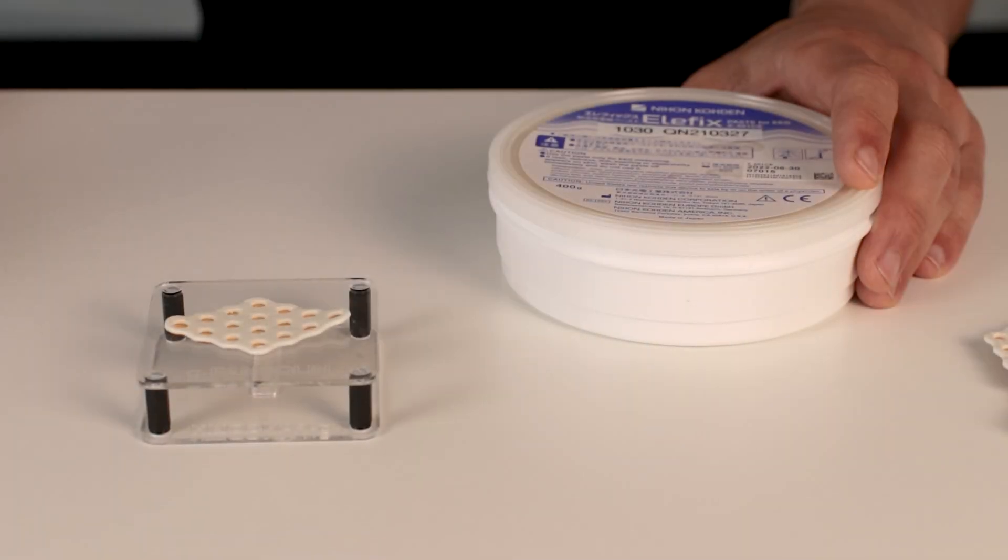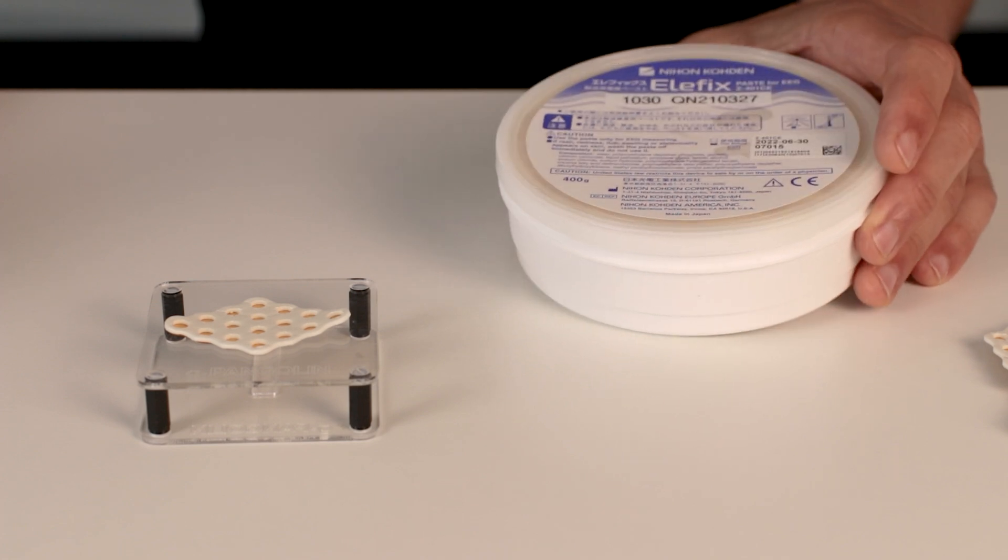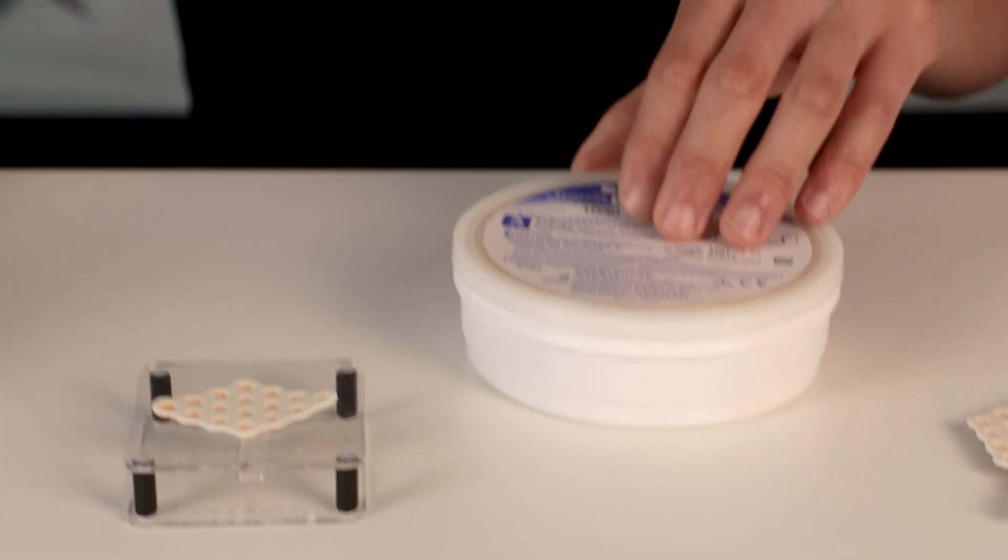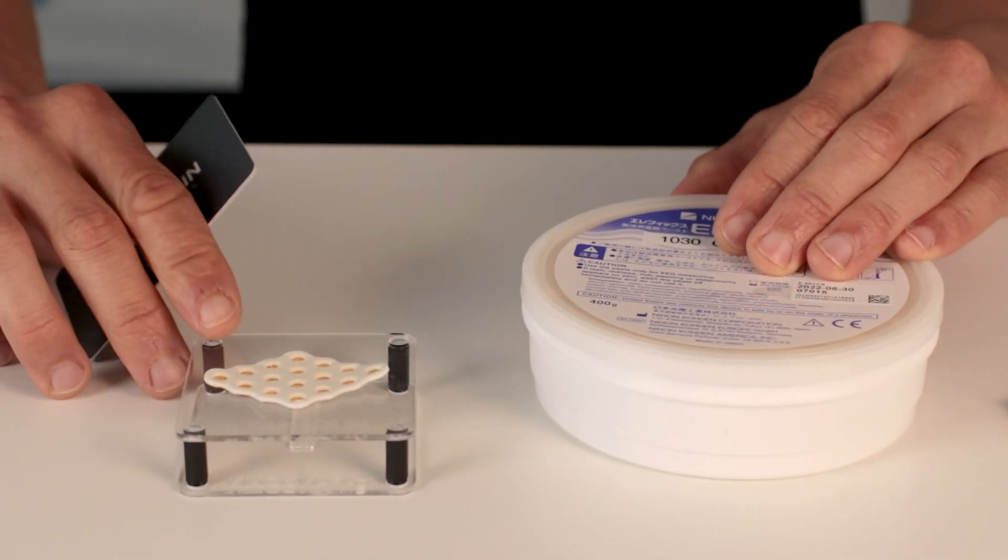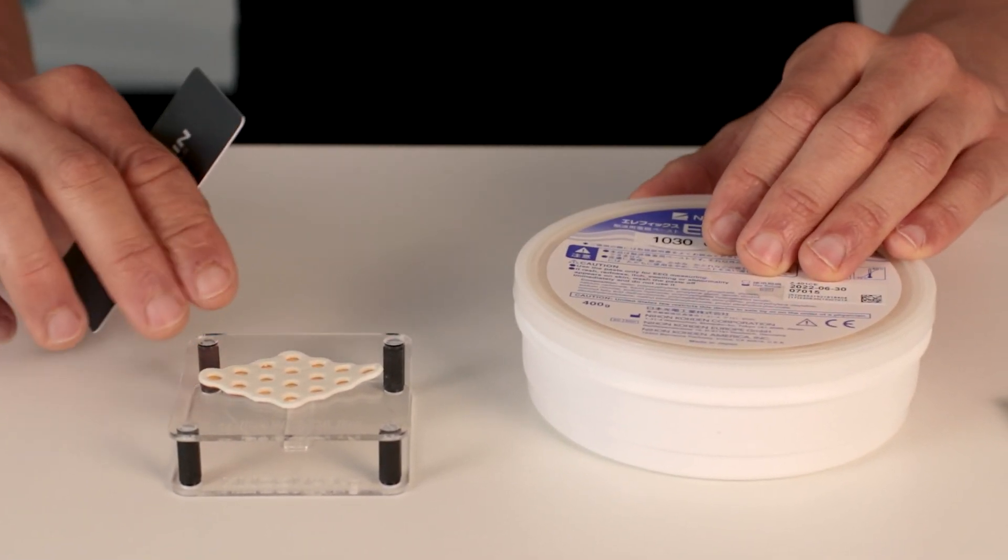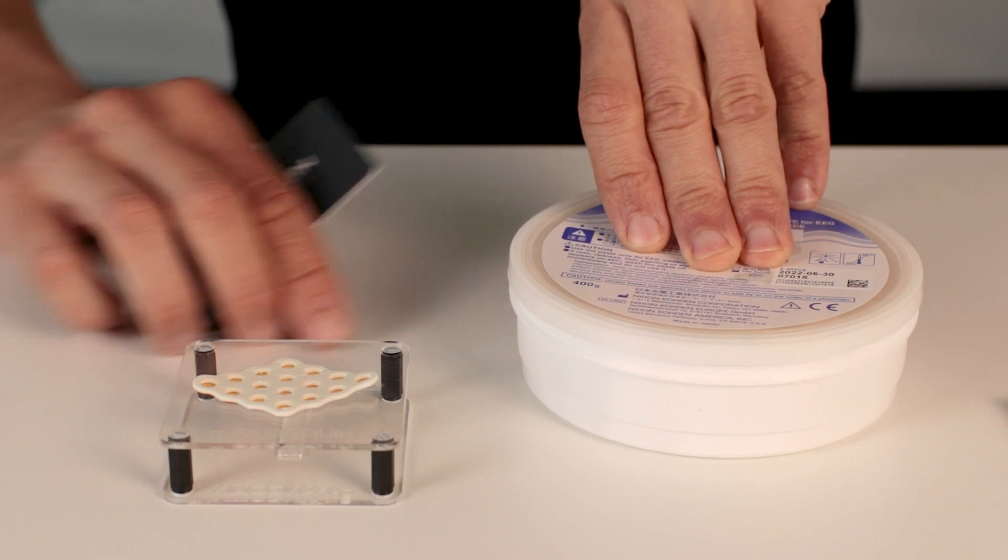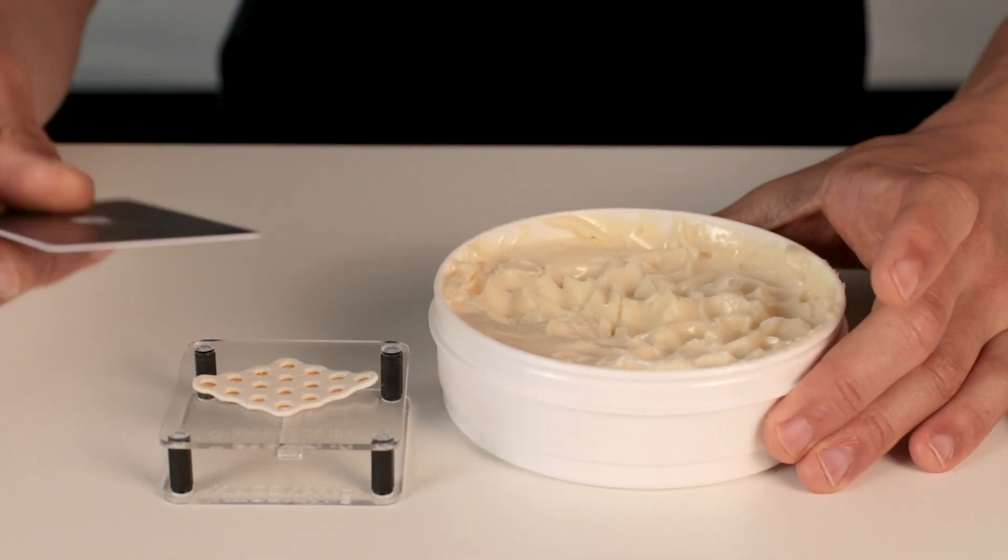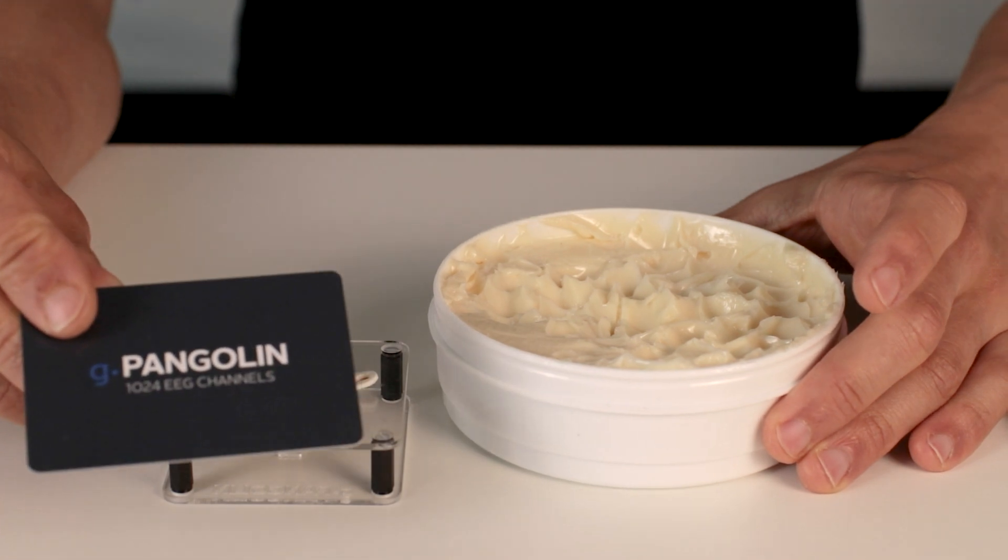As a next step we apply the conductive LFX gel to the prepared grid with the adhesive. So you place your grid with the adhesive applied into your preparation tool and we apply the LFX gel with this preparation card.